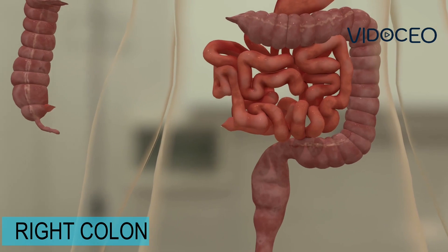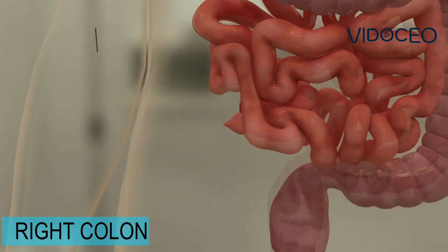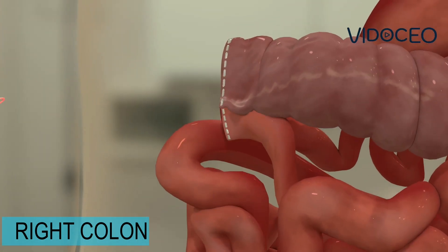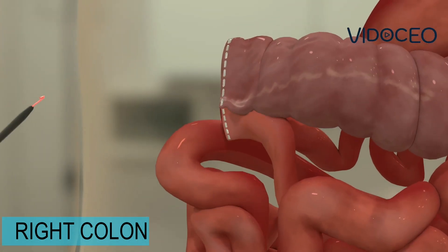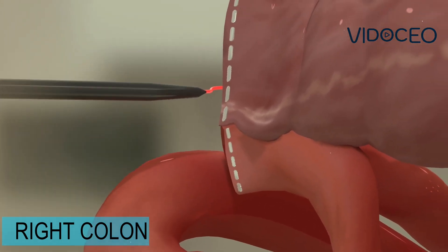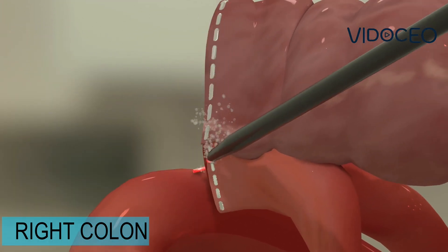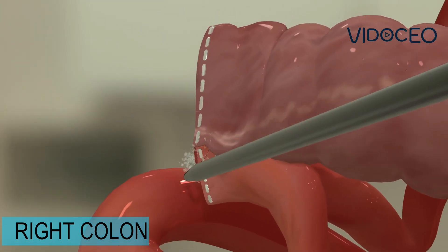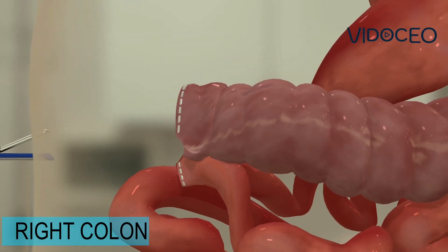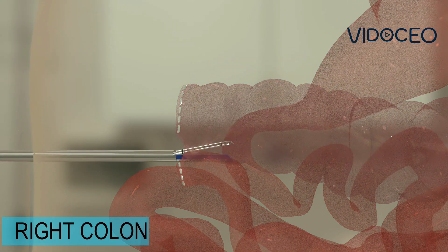The right colon is removed from the abdomen. The end of the small intestine and the colon are then placed next to each other. A hole is made in the ends of the two pieces of bowel, and the reconnection of the small intestine to the colon is performed with another stapler.